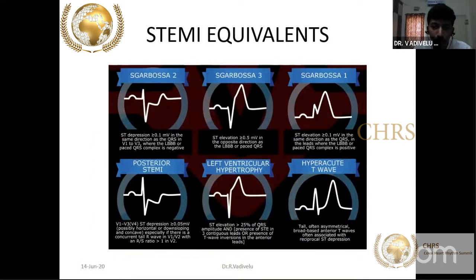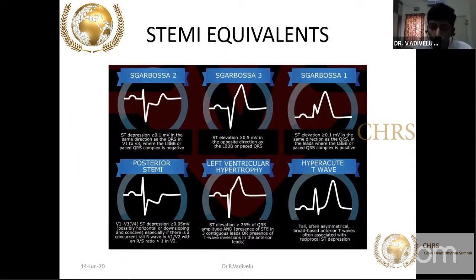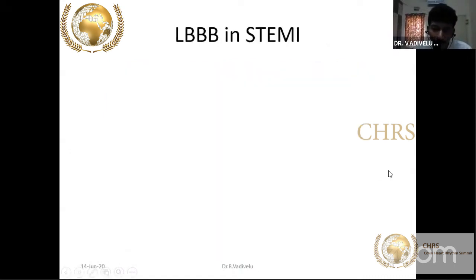New onset left bundle branch block can present as an anterior wall MI equivalent. I will show you all the Sgarbossa criteria. It is very difficult at times to differentiate left ventricular hypertrophy from acute coronary syndrome. A hyperacute T wave is also the initial manifestation in some patients with anterior wall MI equivalent.